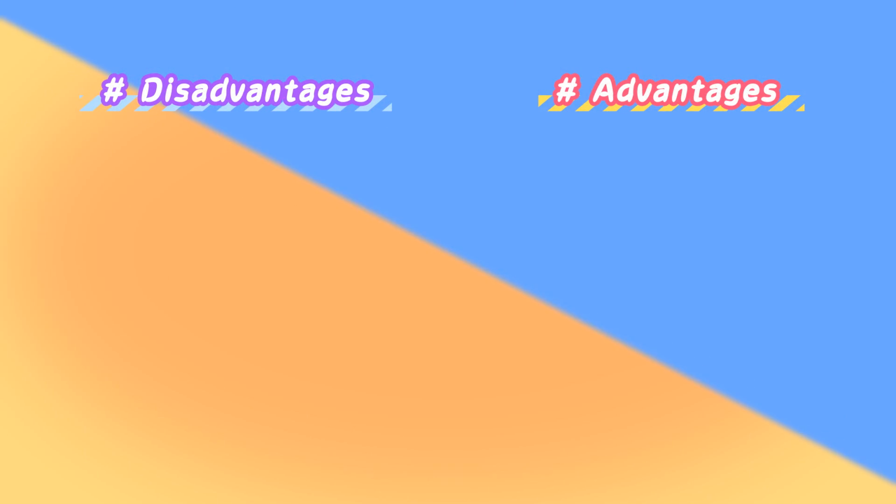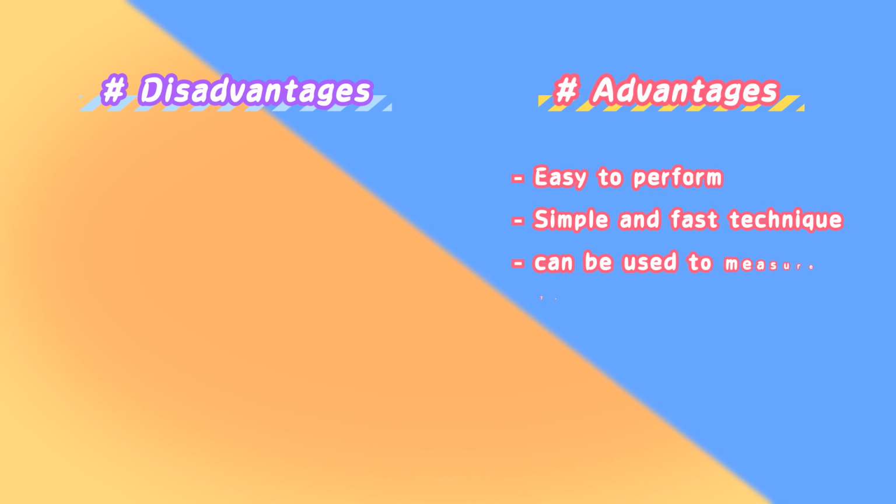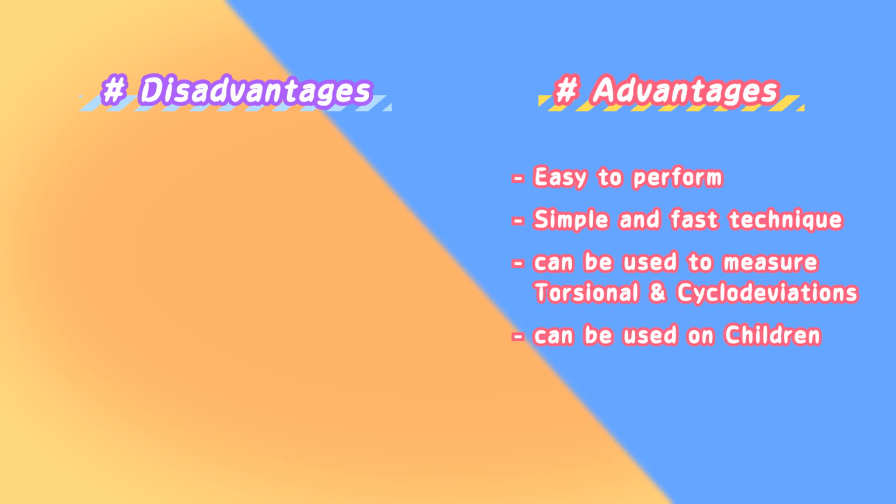Advantages of the Maddox rod test. It is easily performed, it is a simple and fast technique. It can be used to measure torsional and cyclodeviations. It can be used on children.